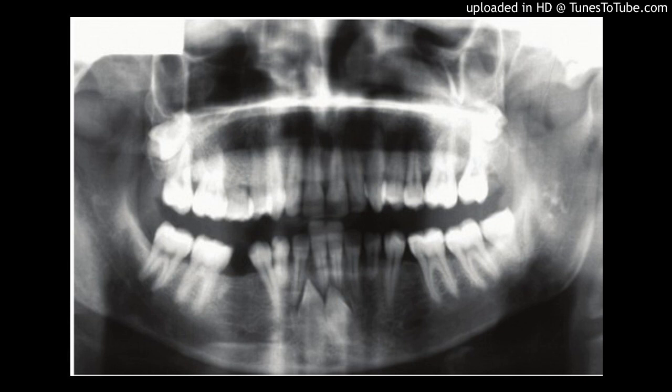their maxillary counterparts. The aim of this study was to provide a detailed analysis of 3D radiographic imaging data of impacted mandibular canines. Materials and methods. In a retrospective cross-sectional study, CT/CBCT data of 88 patients with a total of 94 impacted mandibular canines were analyzed.